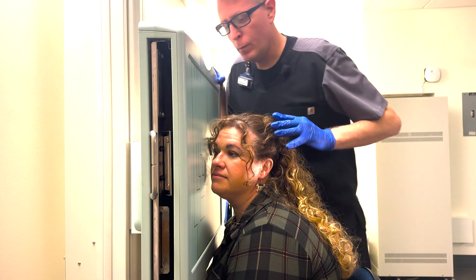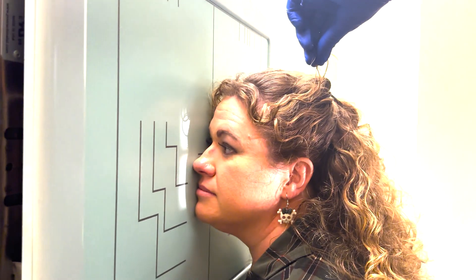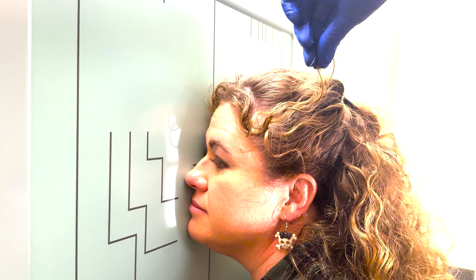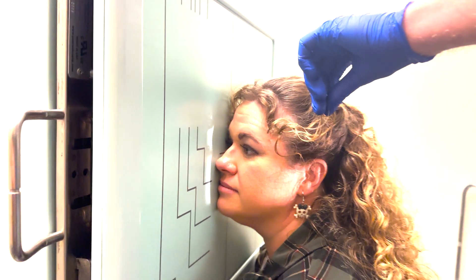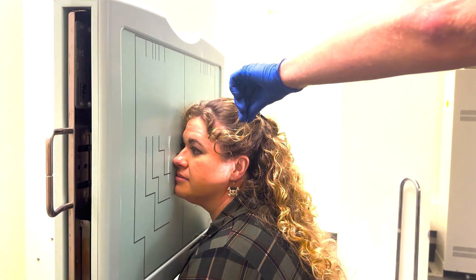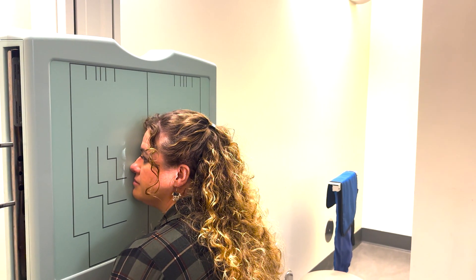We'll need to turn your head a little bit more so your nose is resting against the point. All three points should be in position, AML lined up. And if you achieve the correct angle and hit your collimator light and open side to side, you should see your patient's eyelashes. You can see her eyelashes — that tells me she's at the correct angle. So I can collimate back to where we had it, and just have your patient hold still, don't breathe, don't move, and expose.